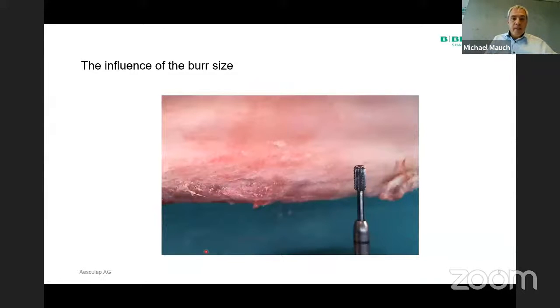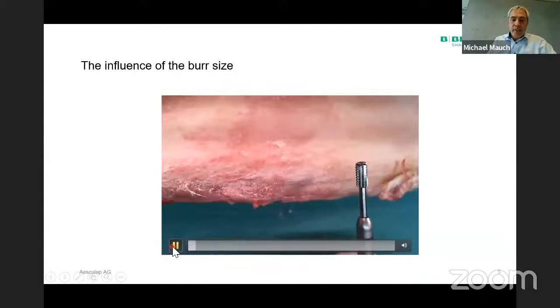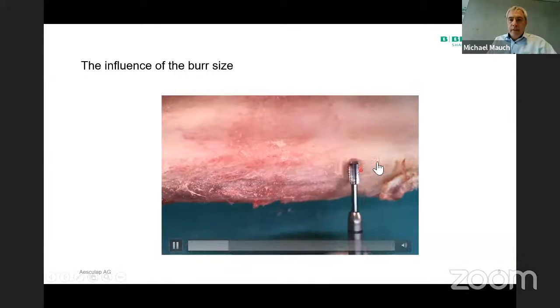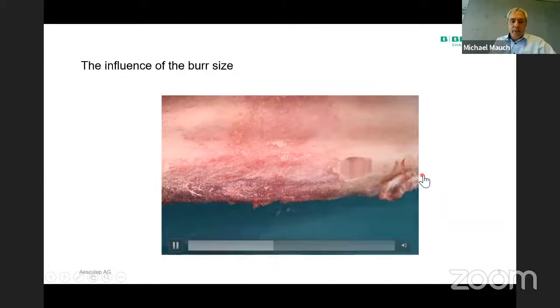Let's see this in the following example. We have here a 4 millimeter burr. Here you see that this plunges into the bone, and it creates a notch. And after this, it's difficult to recreate an even surface.